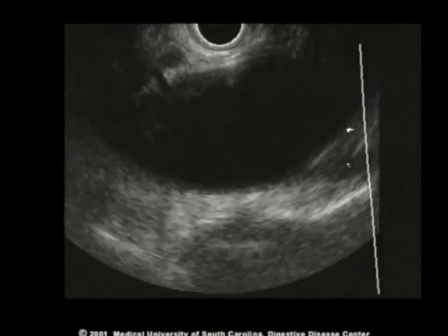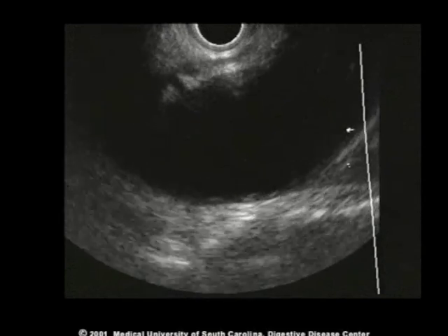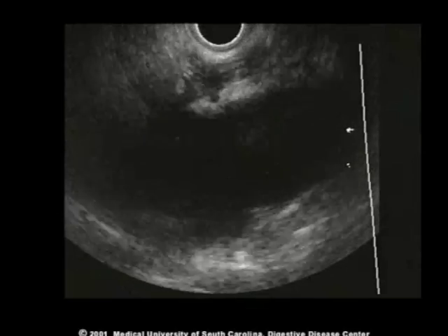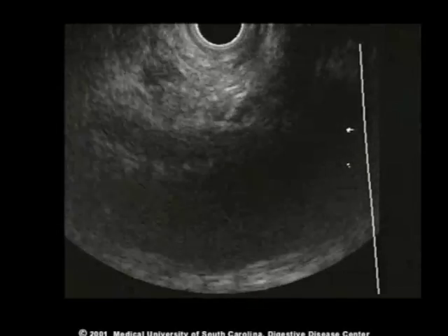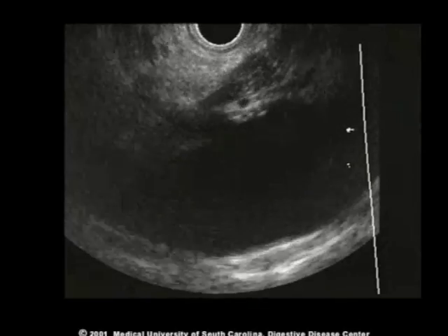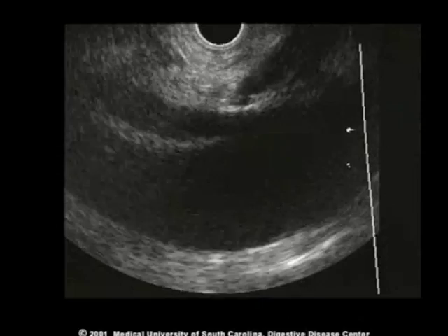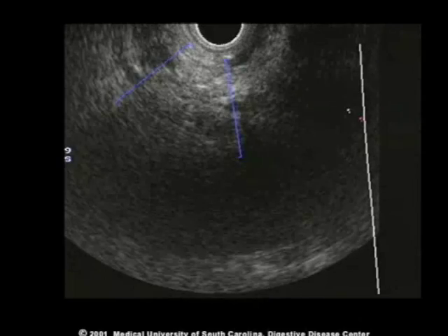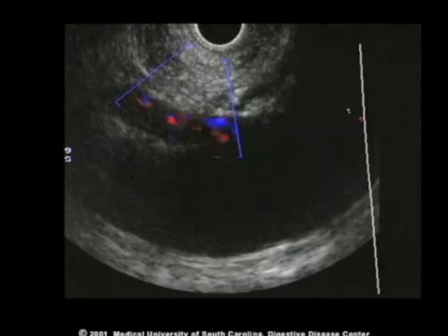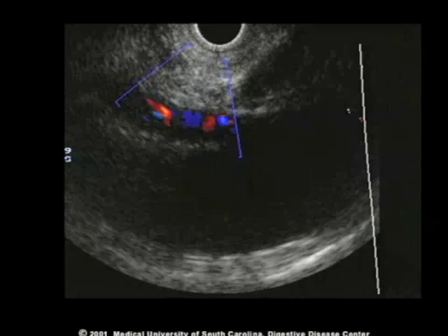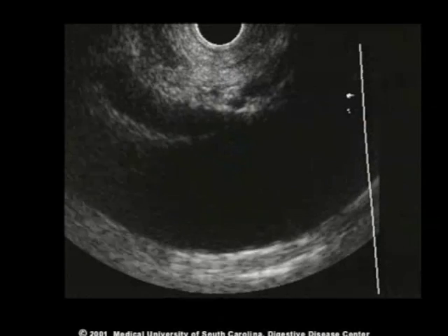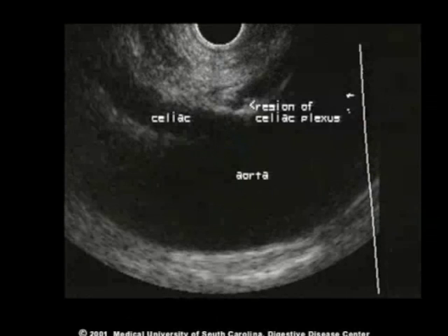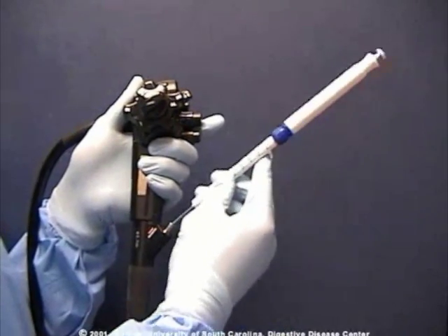Once the aorta is identified, the echo endoscope is advanced forward through the GE junction. The first major artery to come off anterior to the aorta is the celiac artery. The space immediately superior and cephalad of the celiac artery is the region of the celiac plexus.